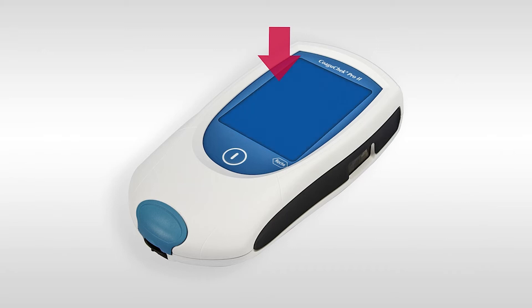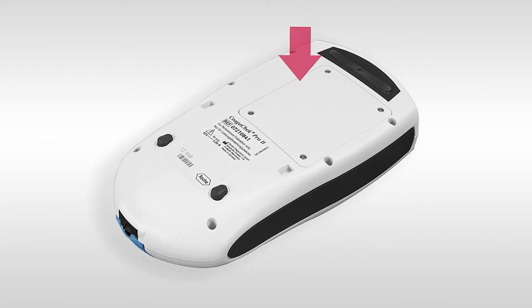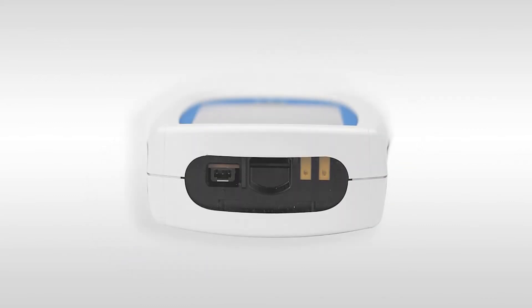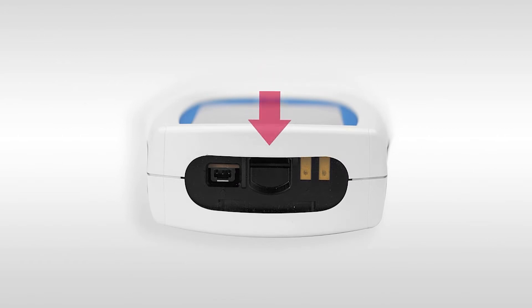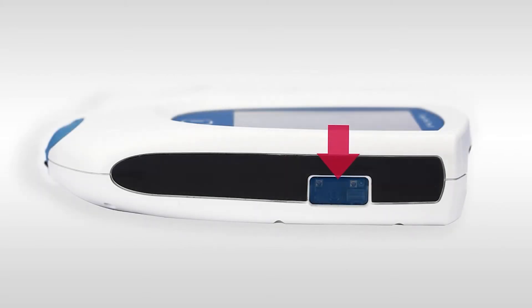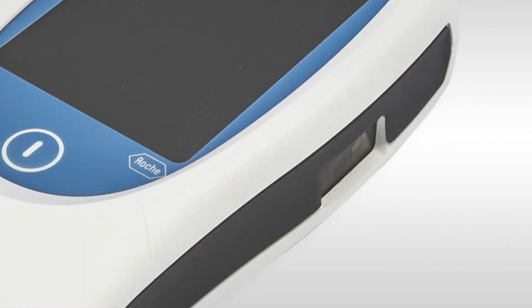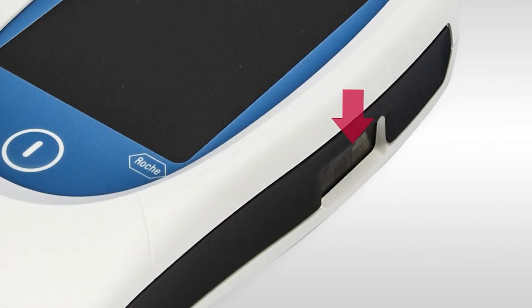At the bottom of the meter you will find the test strip guide for inserting test strips. At the rear of the meter you will find the battery compartment. At the top of the meter you will find the code chip slot for inserting the relevant code chip, and also the connection socket to plug in the power supply unit. You will find the barcode scanner on the right side of the meter.